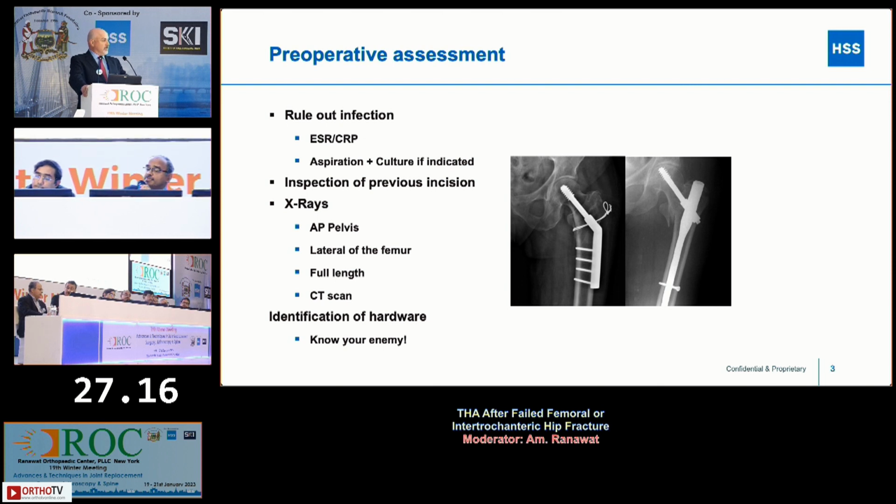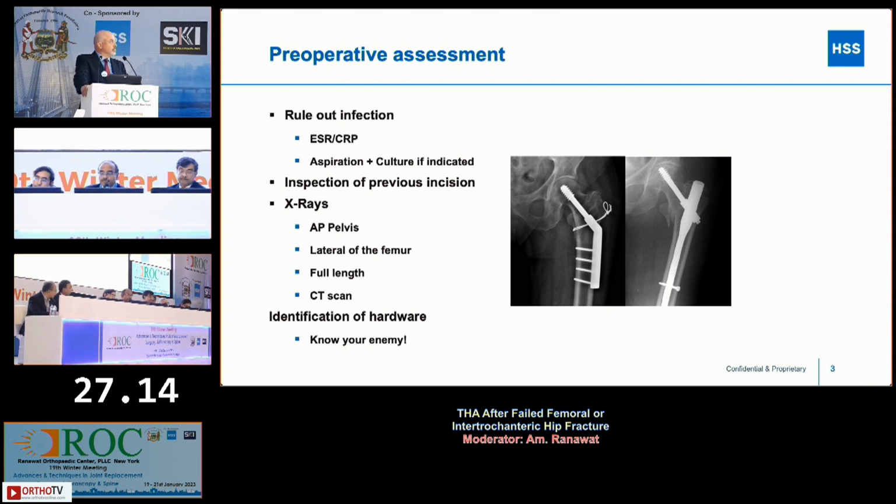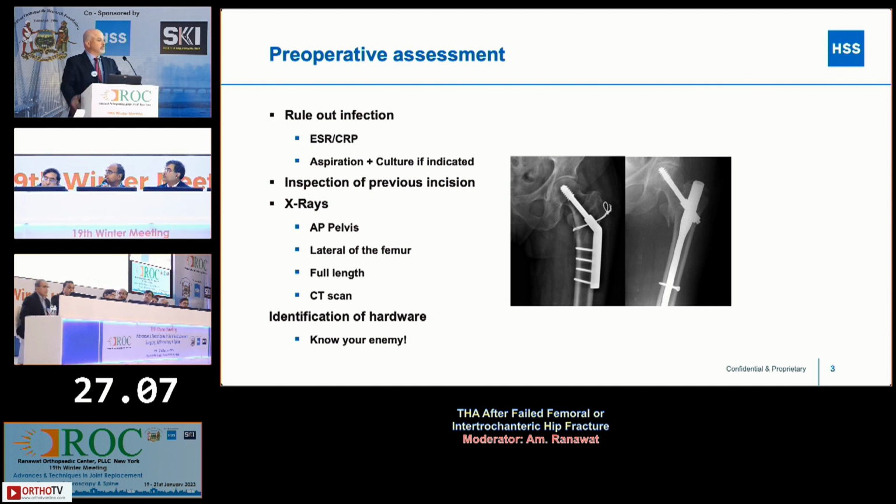Sometimes, with some implants, you may not have those kinds of screwdrivers. Once I failed to take out the implant because it had a star-shaped screw head. I didn't have a star screwdriver ready on the table. Right. So that is the problem. So you have to know the company and what implants are required to extract it.